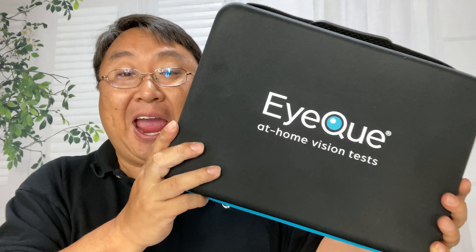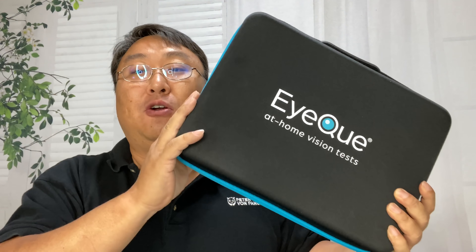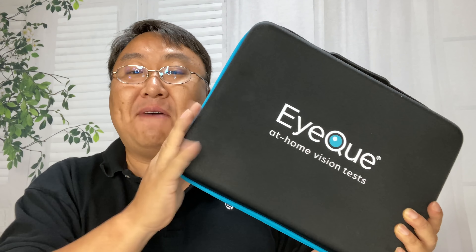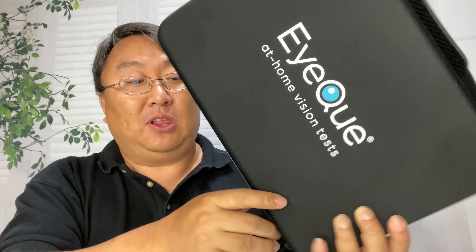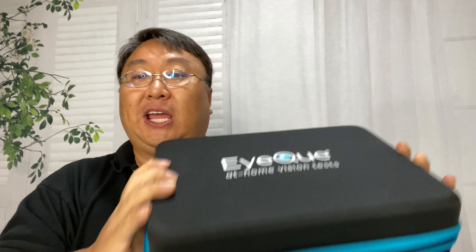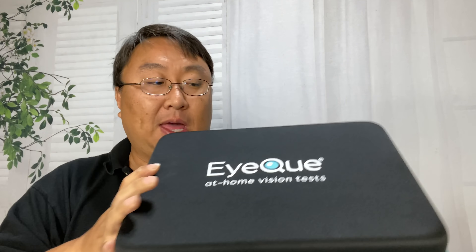Well, enter this — this is EyeQue IQ, an at-home vision test. This little box has just about everything, but I want to focus on the pieces that allow you to get the information you need to order glasses yourself, and then I want to tell you about my experience using this and ordering glasses.